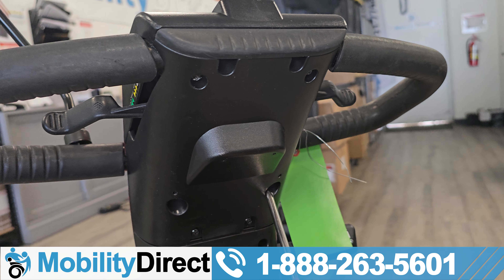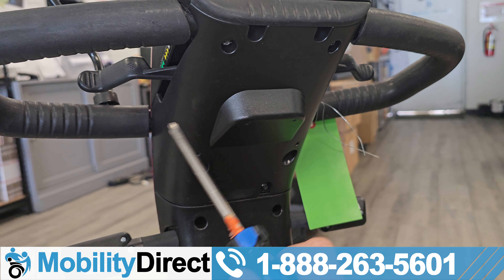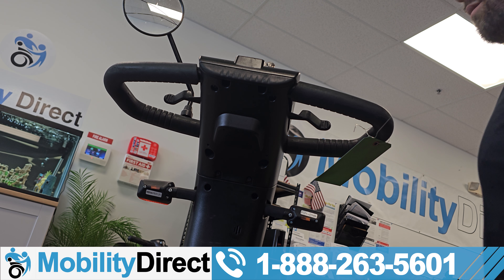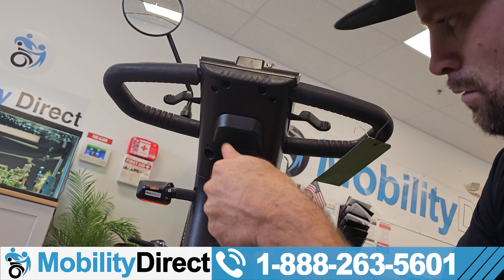This helpful video can guide you into fixing your mobility scooter without any parts or major tools whatsoever. So let's check this out — I'm going to remove the screws that I've indicated.